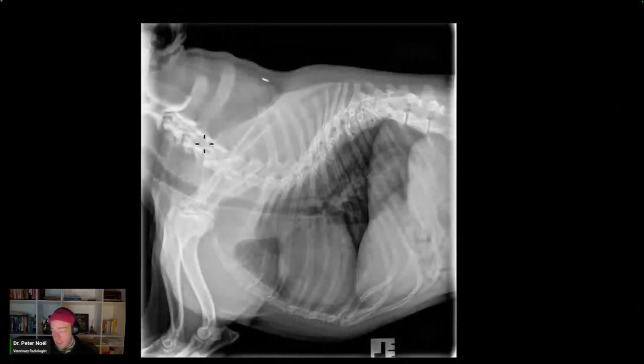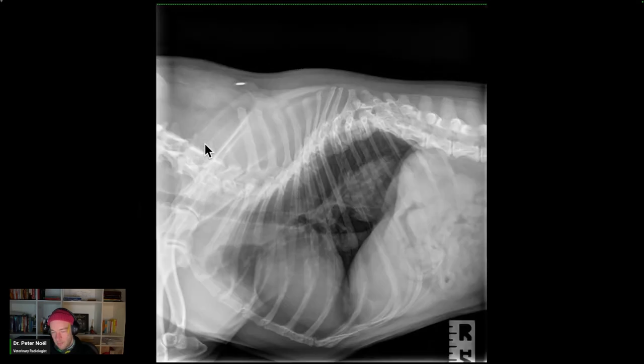You can go ahead and, let's not be coy. It's in the area of the lower esophageal sphincter. It's in the area of the caudal esophagus. What's interesting is you can see on this one, part of the Röntgen sign is the margin. So what's interesting is the cranial border, most of it is pretty discernible. So you can say it's cranially convex and it's fairly discrete. The caudal border is indistinct. I don't see where that ends.